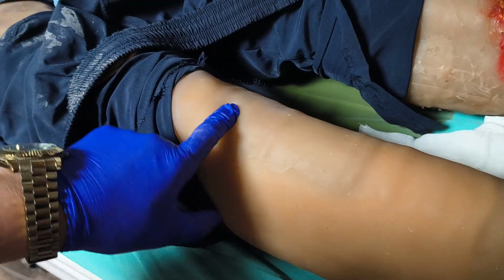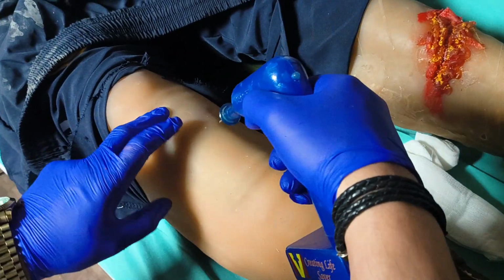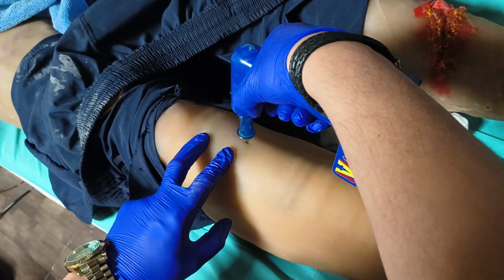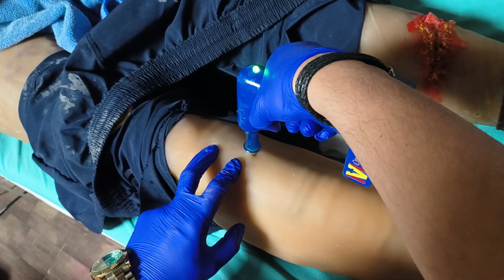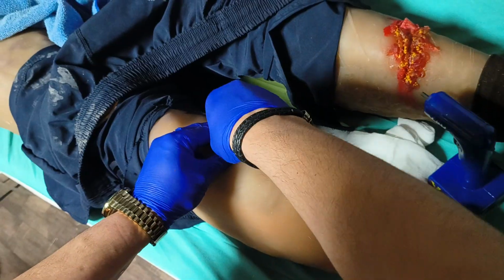So knee joint, this is the tibial tuberosity, anteromedial surface. We have to go 1 to 2 centimeters, till we get a feeling.